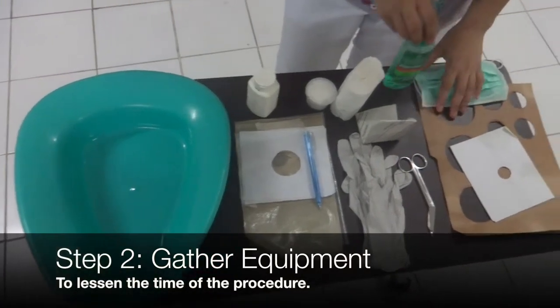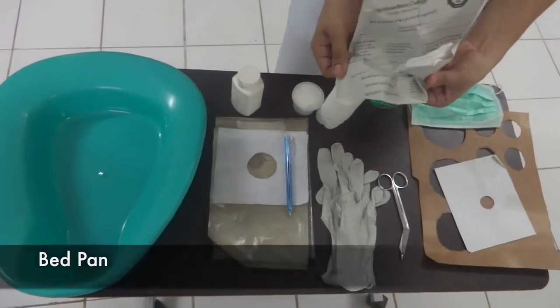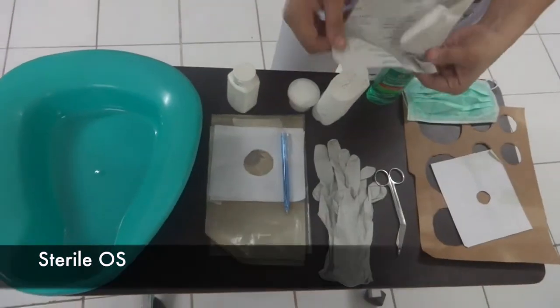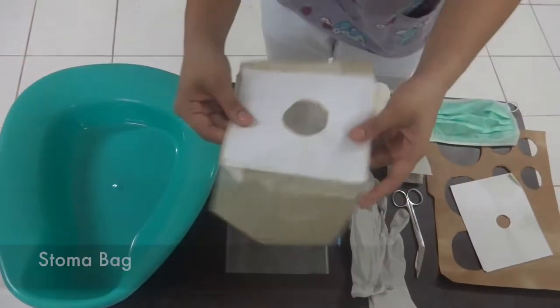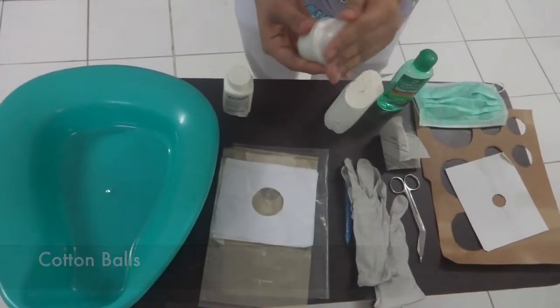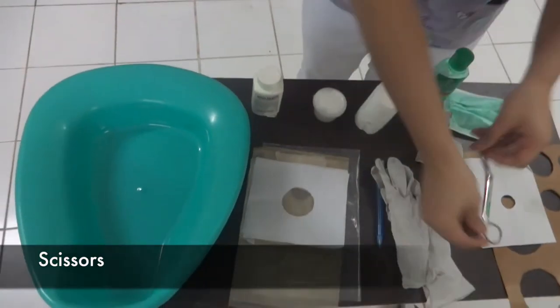Step two: Gather your equipment, such as the bedpan, a mask, alcohol, sterile gauze, gloves, a ball pen for measuring, a stoma bag, powder, cotton balls, a stoma guide for measuring the stoma, scissors, and a towel.